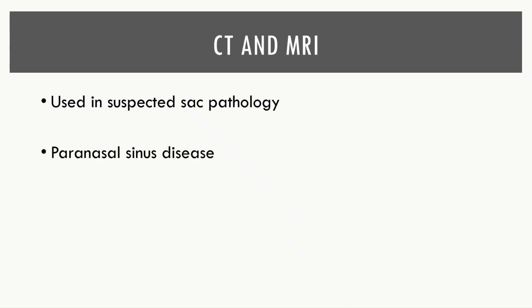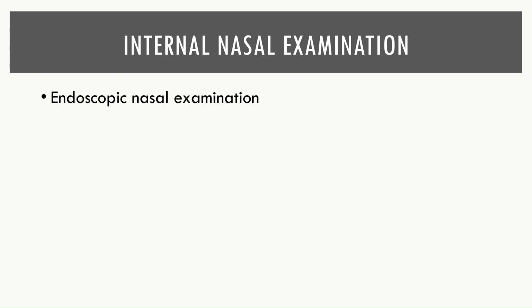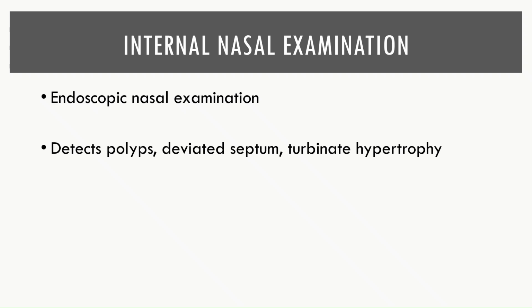CT and MRI. CT and MRI are useful in selected cases, especially when lacrimal sac tumors, sinus disease, or trauma are suspected. Internal nasal examination. It is done using endoscopy. It is valuable to detect nasal polyps, deviated septum, or turbinate hypertrophy and is essential before planning surgery.